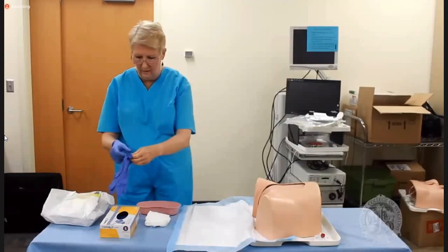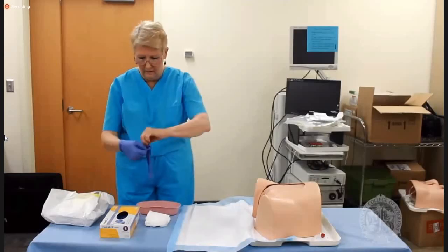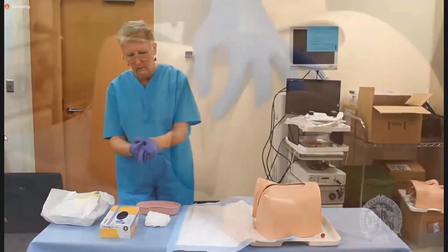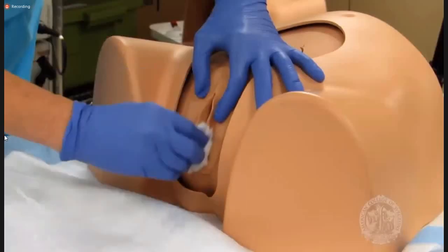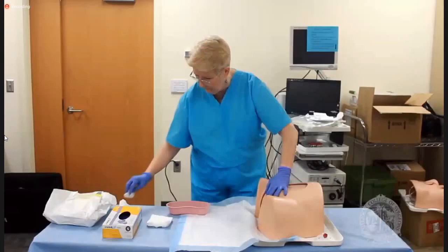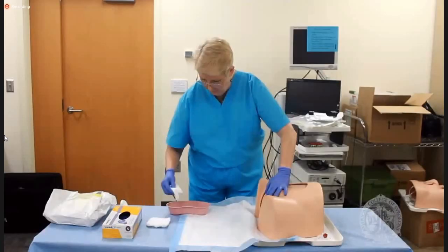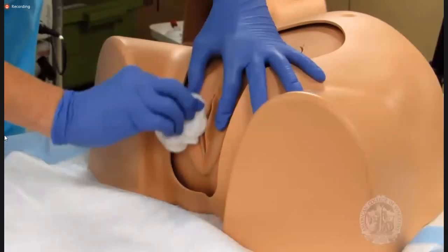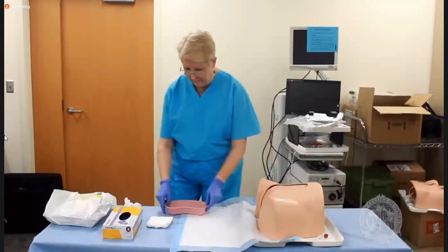Positioning is key for this procedure. Place the patient in a supine position with their knees flexed and soles together in a frog leg position. Place a waterproof or absorbent pad under their buttocks and upper legs. Ensure privacy for the patient. Sanitize your hands and put on non-sterile gloves. Cleanse the vulva and perineum with towelettes or with soap and water.